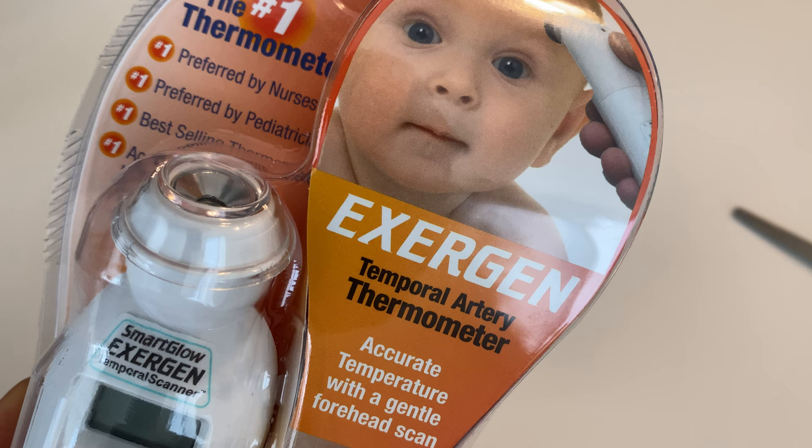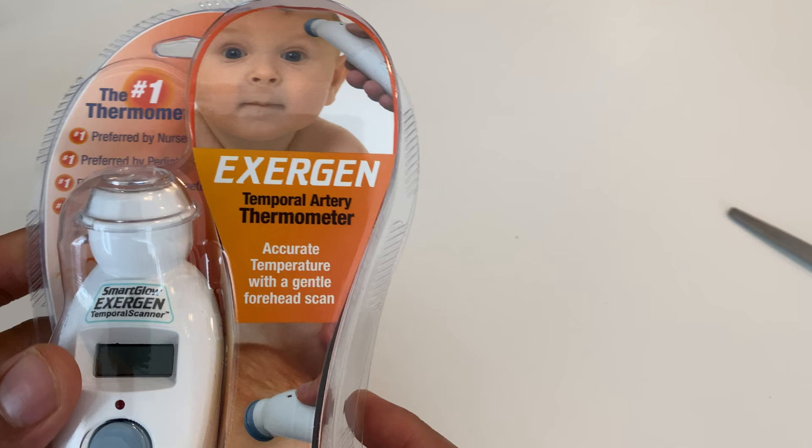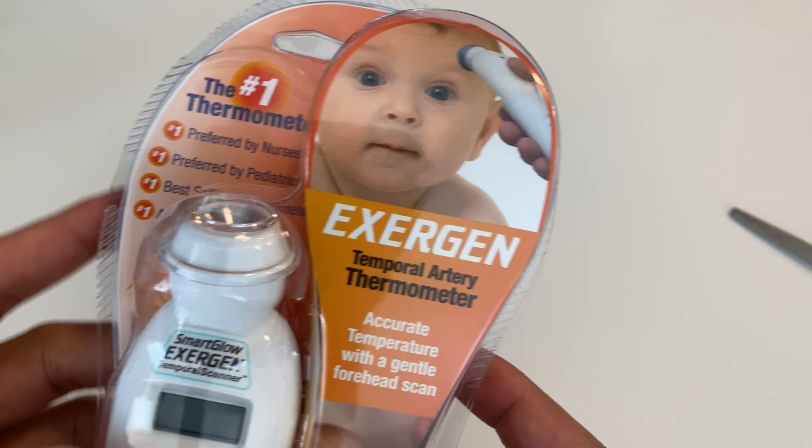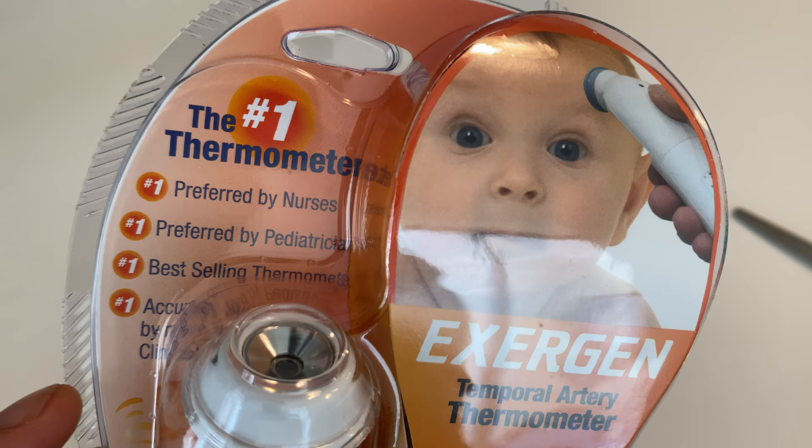Alright, this is an unboxing of the Exergen Smart Glow temporal artery thermometer. I picked this up just recently at Target. Thermometers are hard to come by now — they're being sold out at a record pace due to the current situation the world is going through. I'm going to open it, but first let's look at the outside.